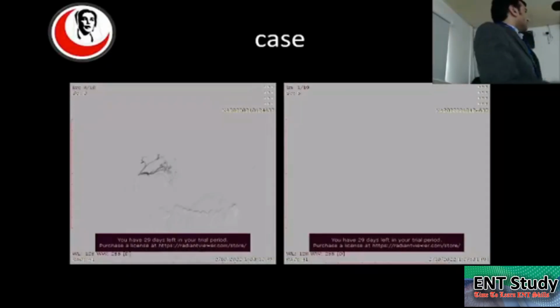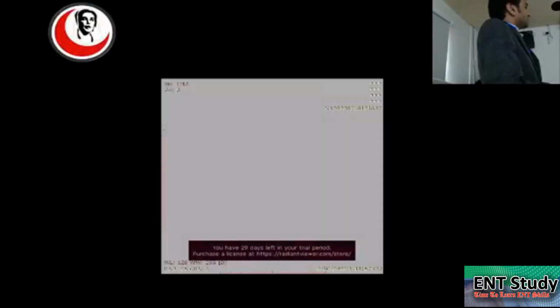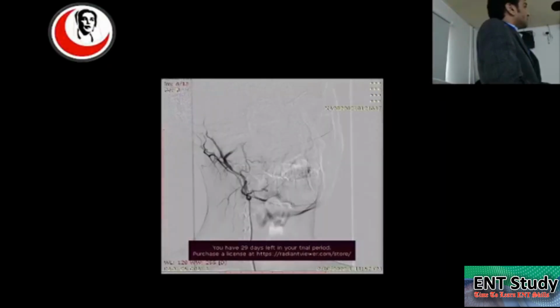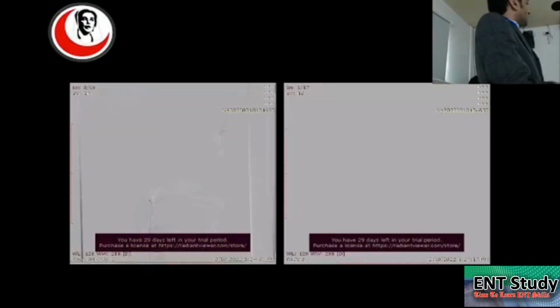Another case of pre-surgical embolization, a large blush was embolized, no blush identified. Check angiogram of the external carotid artery showing here we see the blood supply from the branch of the facial artery, which we selectively cannulated. The blush was identified and embolization done, there is no blush.